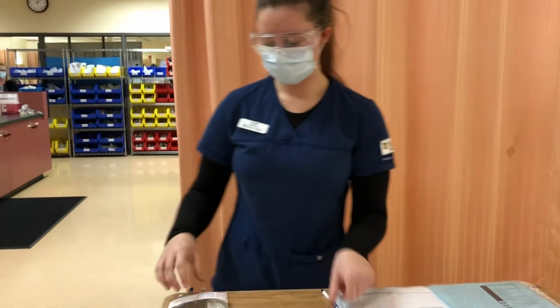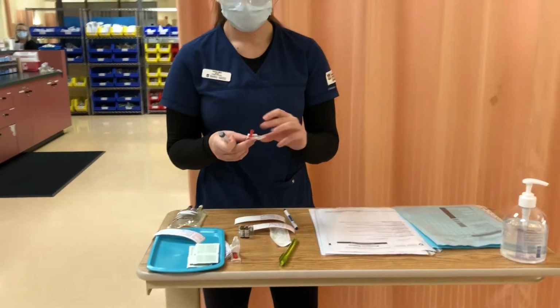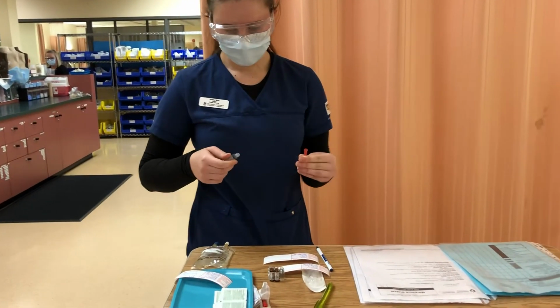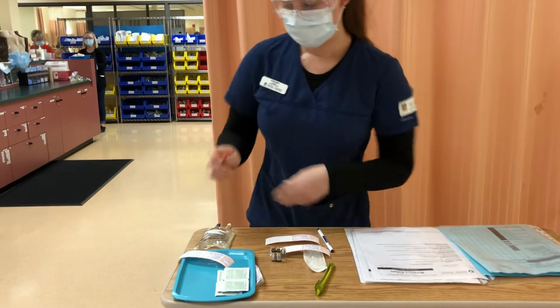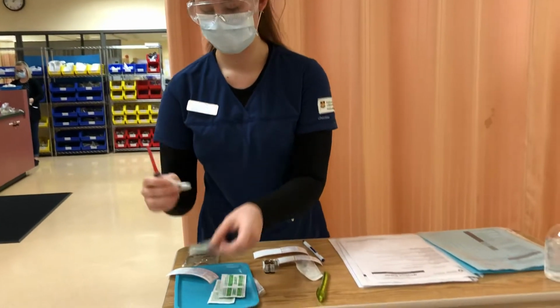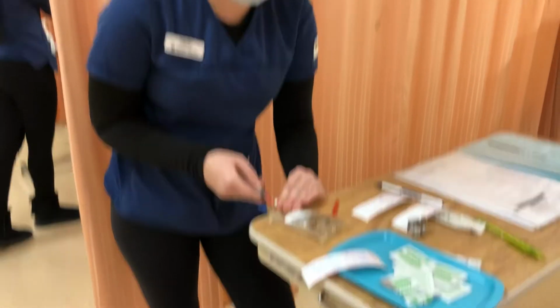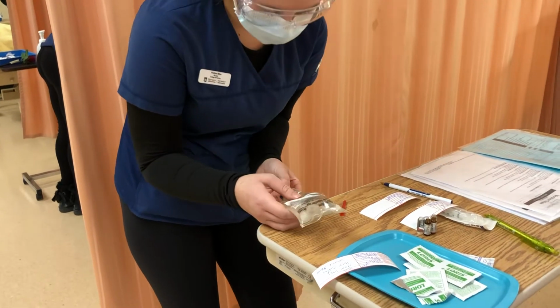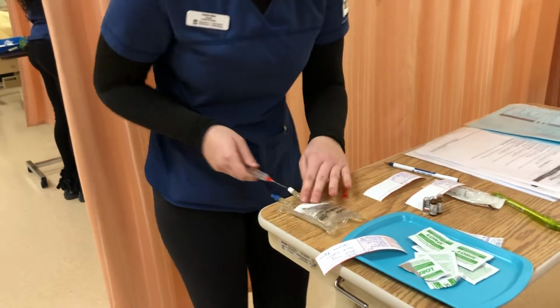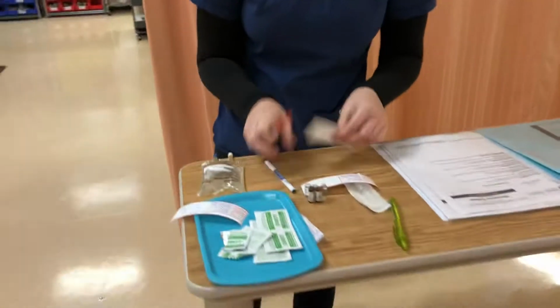So now I'm going to be pulling up the normal saline that I'm discarding. So again, I want 5 milliliters because this is a 50 milliliter bag, and I only want 45. This blunt fill doesn't actually have a blunt fill, so I'll be using this one. So I will be cleaning the mini bag for 30 seconds and drying for 15. And I'm pulling out 5 milliliters. And I'm going to make sure that I do have 5 milliliters. And that is 5 milliliters. So I'm going to label this and put it off to the side.